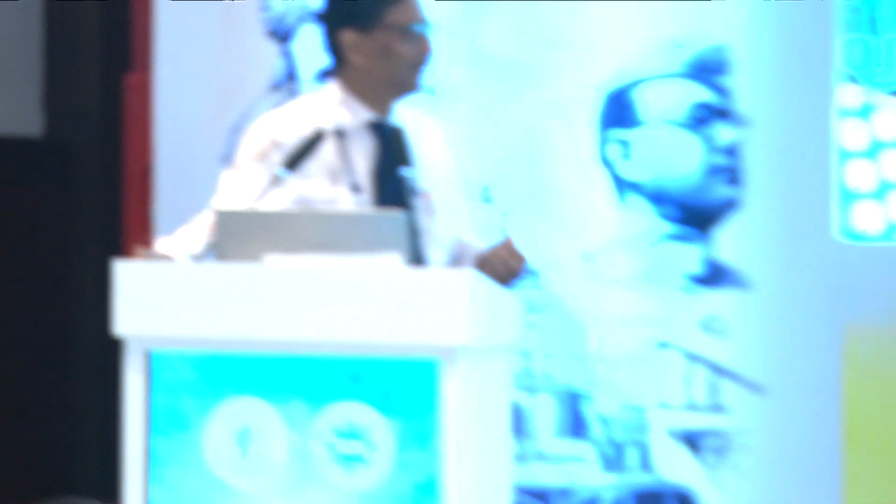Dr. Santosh sir, one of the judges' questions: do you do this AC paracentesis in all the cases of intravitreal injections, or only in cases where you have the risk of glaucoma, or the patient is already a glaucomatous patient? Yes, in those cases it is mandatory. And I'm also asking about multiple injections in endophthalmitis, and also in triamcinolone because it's a high volume. Mostly in triamcinolone.